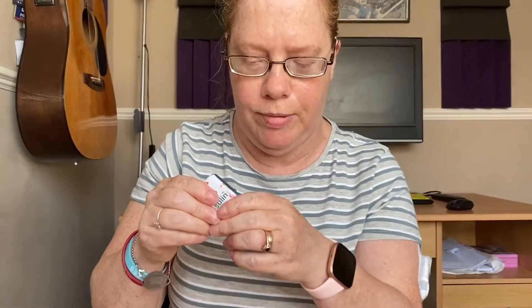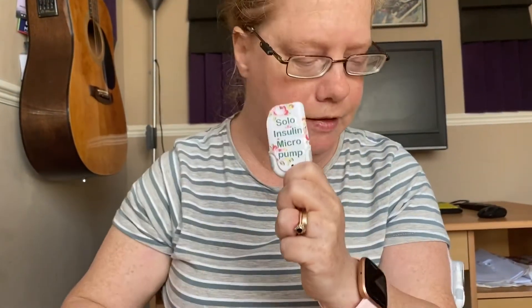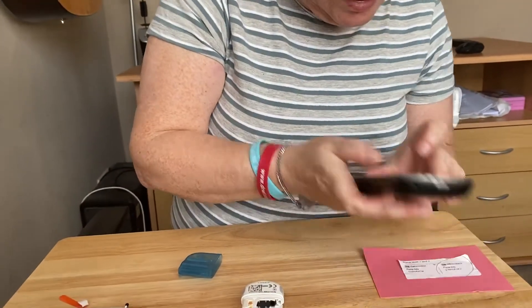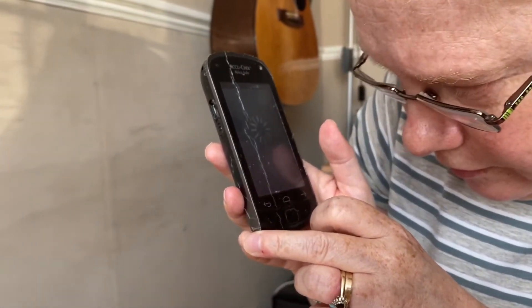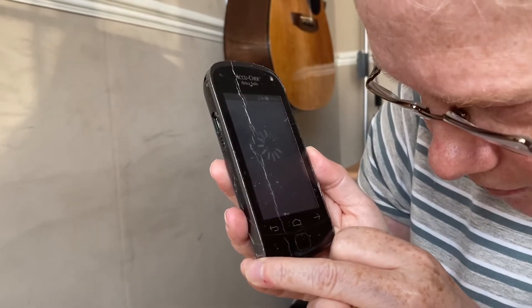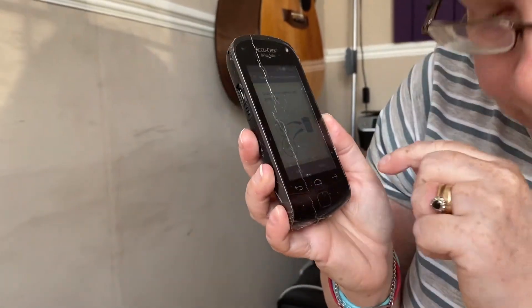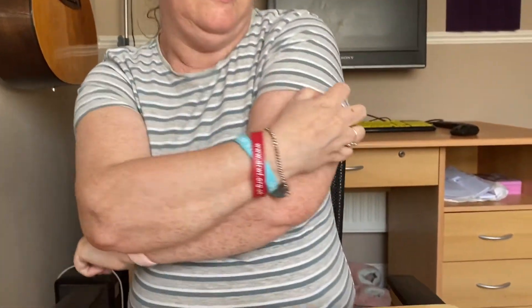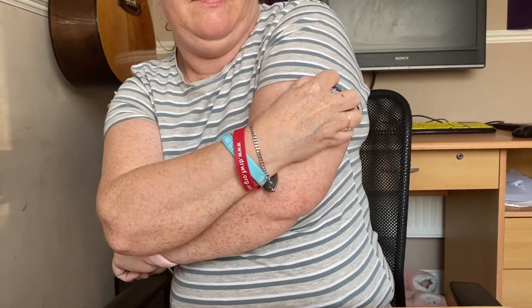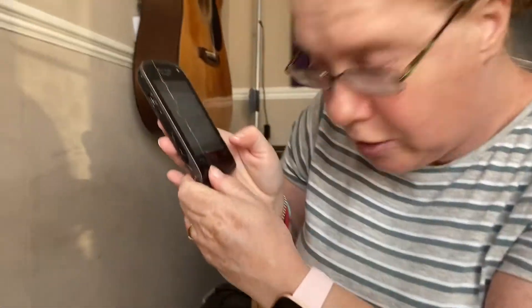This is the new pump base. First I'm going to take the blue bit off — like that. Then I press replace on the handset, which shows the twirly animation. It wants me to take off the old pump base and put it in the bin, so I take the old one off and set it to the side. Then I press done.